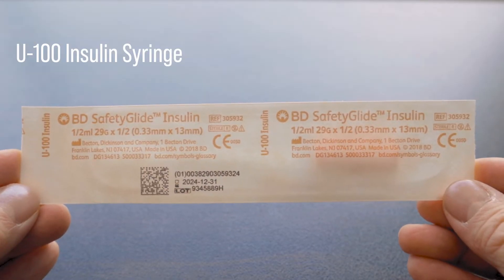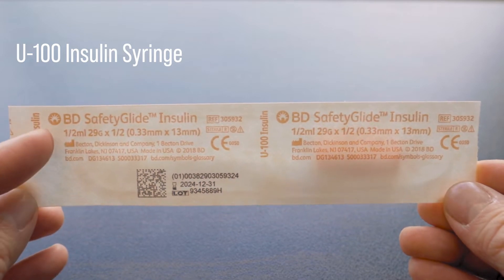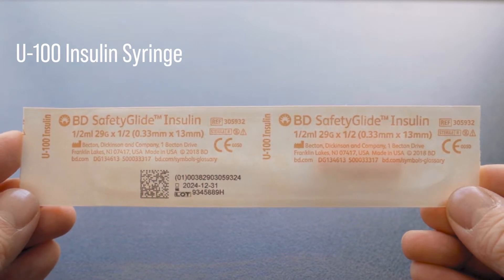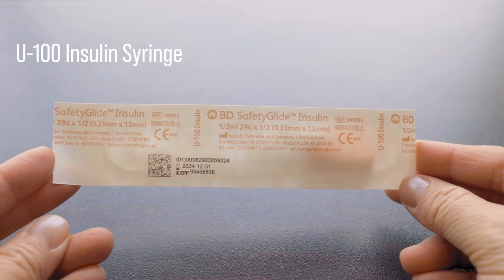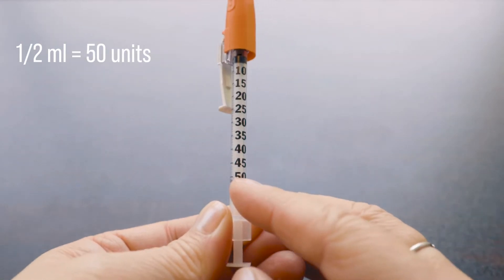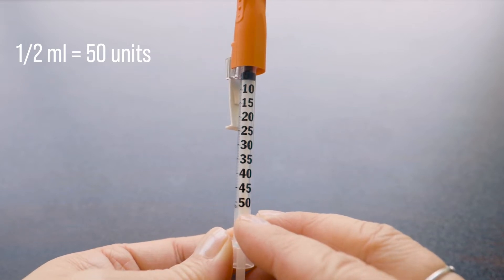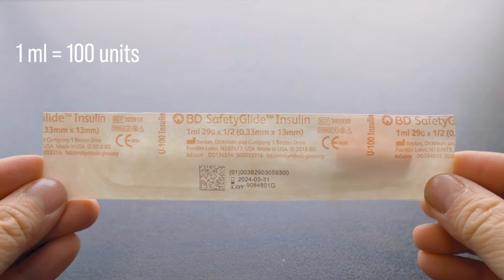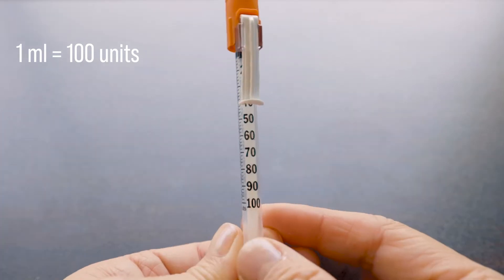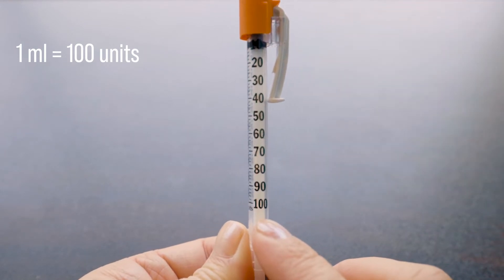A U100 insulin syringe. Here we have a half ml syringe with a 29 gauge needle and it is half an inch in length. We can also see the expiry date, which is December 31st, 2024. So here we can see that this syringe is a half ml syringe, which means it measures up to 50 units of insulin. And here we have a 1 ml syringe that can measure up to 100 units of insulin. So you just need to choose based on the total amount that you will need to administer.